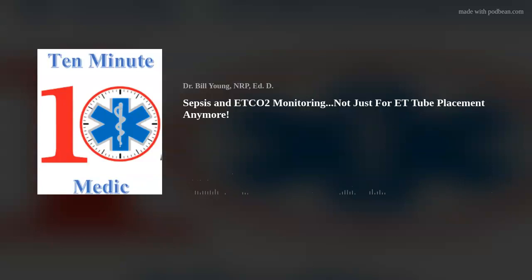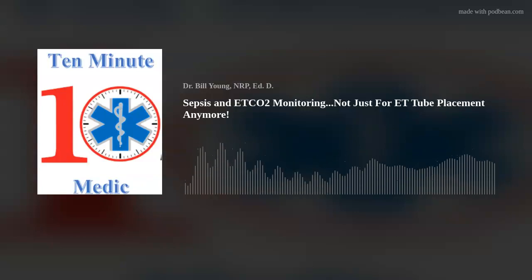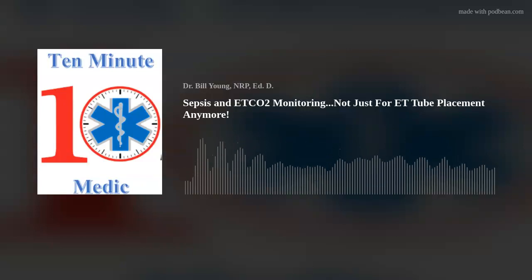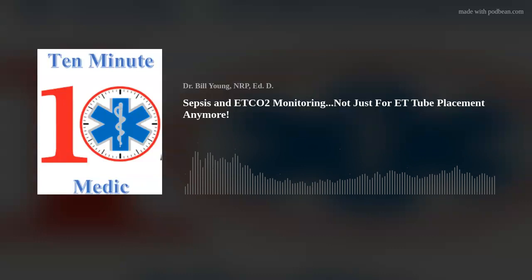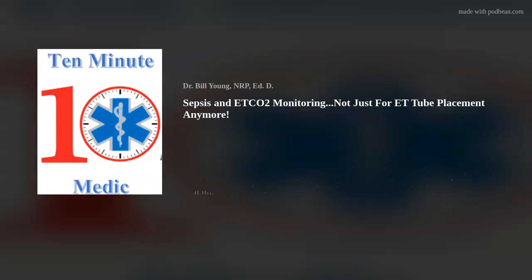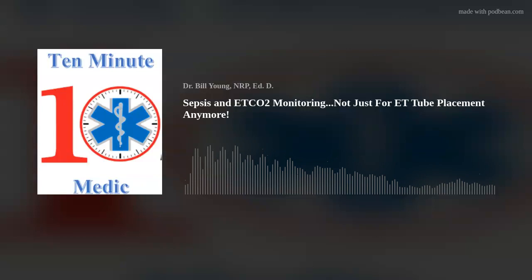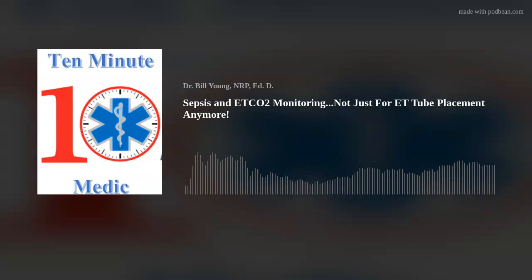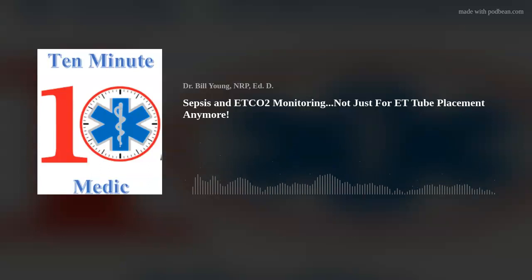life-saving interventions. In septic patients, resuscitation efforts primarily involve fluid administration and, when necessary, vasopressors to stabilize hemodynamics. End-tidal monitoring can serve as a non-invasive marker to gauge the effectiveness of these two interventions. Improvements in the end-tidal readings may suggest enhanced perfusion and organ function, indicating effective resuscitation. Conversely, low end-tidal values, despite resuscitation, may signal the need for further intervention or an alternative therapeutic approach.